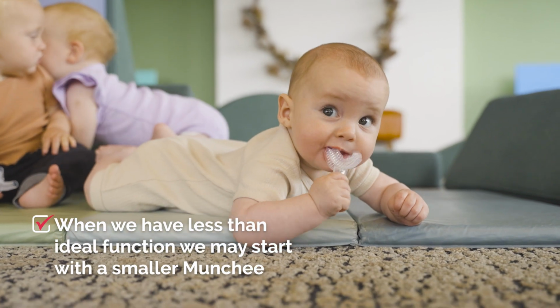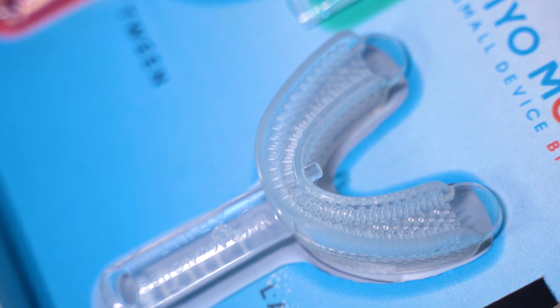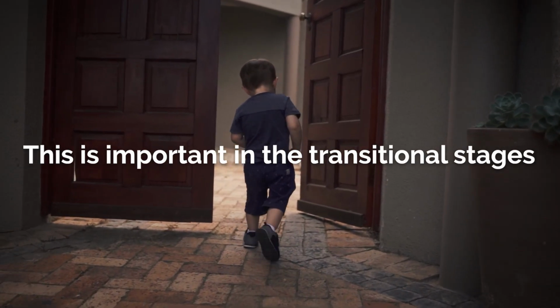When we have less than ideal function, we can need to start smaller with munchie size and work our way up. This can be particularly important during the transition stages.